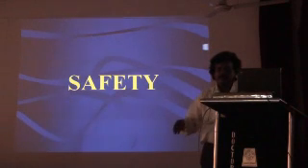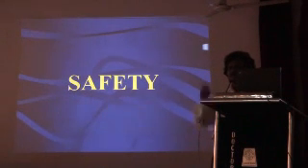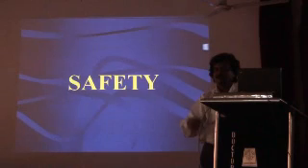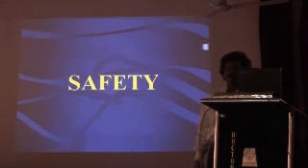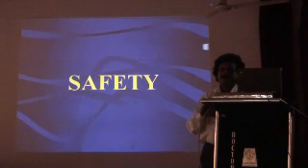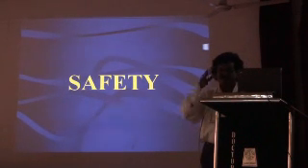And if there is a long, narrow tunnel, if it is not open MR, if the patient is claustrophobic, it is really very difficult to put the patient in without sedation. In fact, we doctors, once I enter the machine, I will not enter for the second time, because the sound it produces is more than 60 to 100 decibels, from the radio frequency pulses in different protocols or sequences.